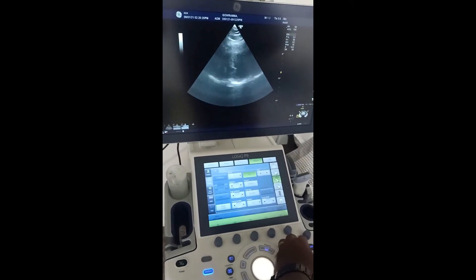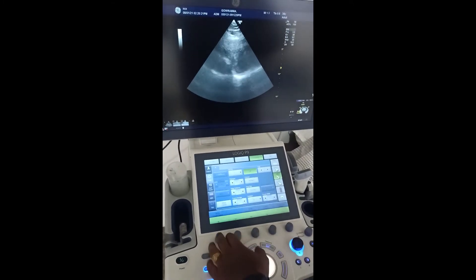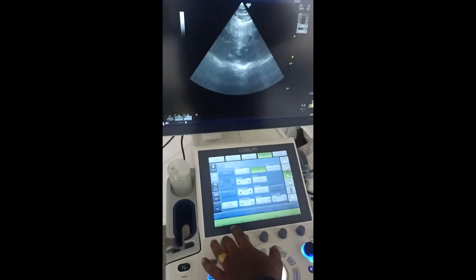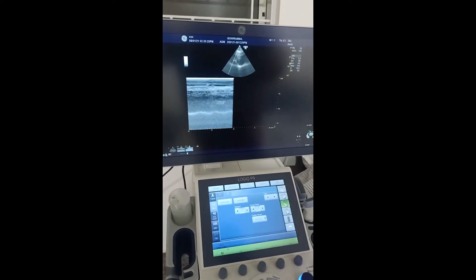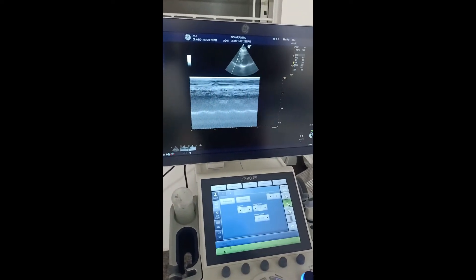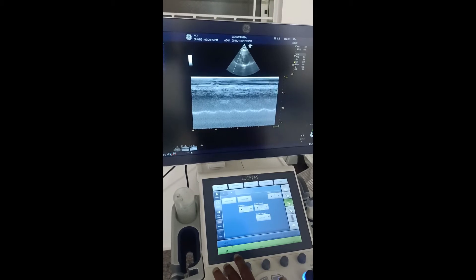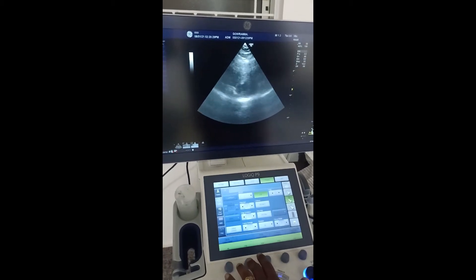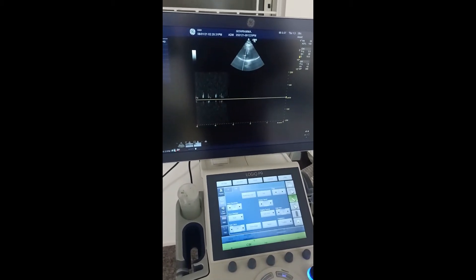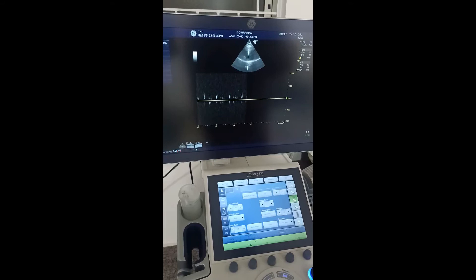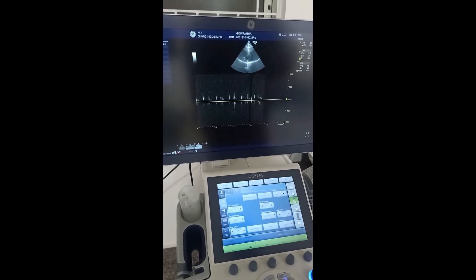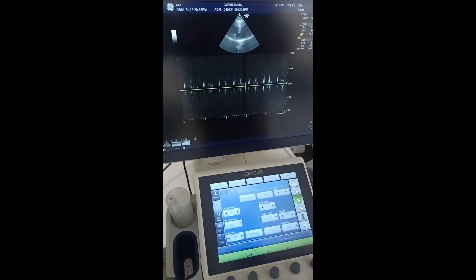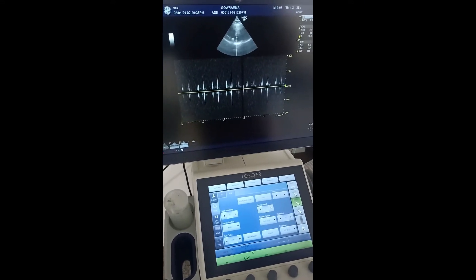I will put a mode. This is the CW mode in cardiac.